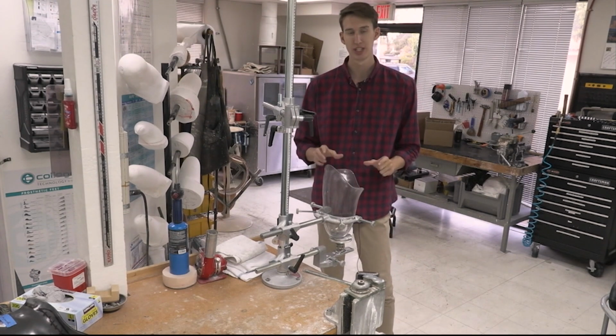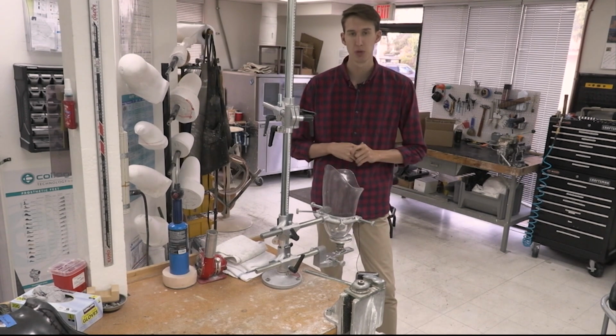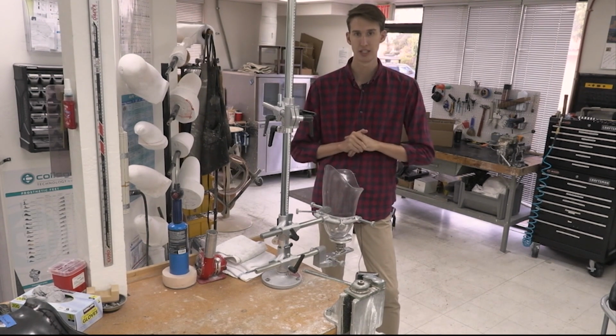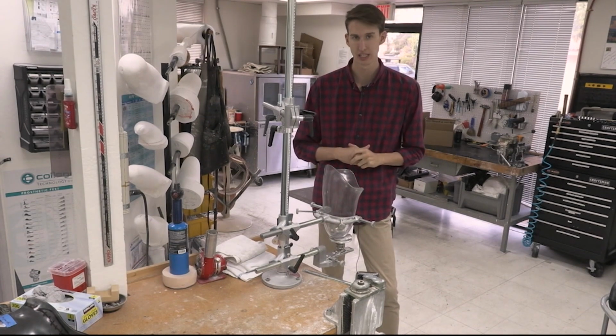The angle in which the socket is conjoined to the attachment plate has to do with the patient's lifestyle, and for Chris, he is very active, so his prosthesis will directly align with his daily activities.